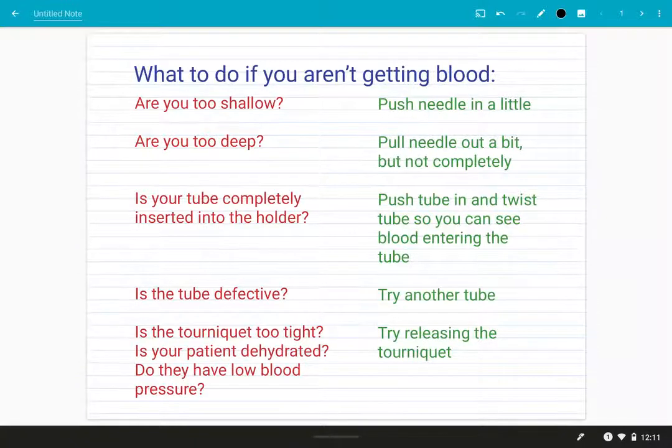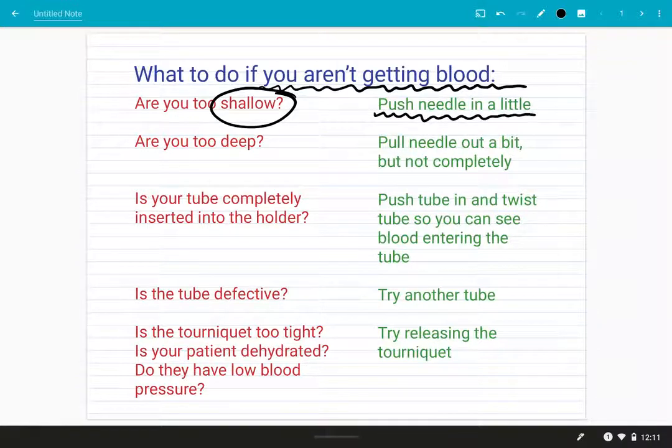In this last segment we'll go over what to do if your needle is inserted but you still aren't getting any blood flowing into your tube. Sometimes your needle is going to be too shallow — maybe your bevel is just inside the skin and not actually in the vessel. In that case you can try to push your needle in a little bit, but be careful not to insert the needle too far.